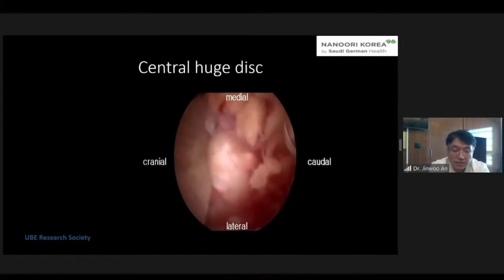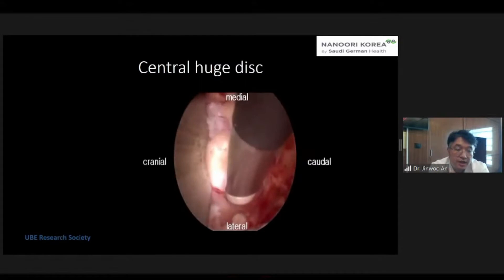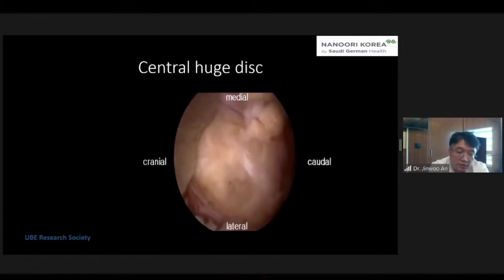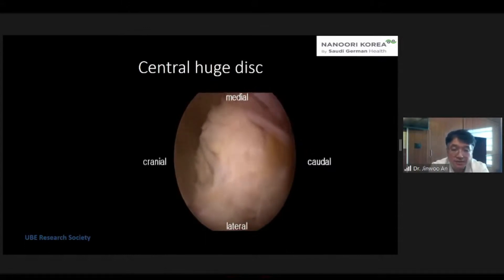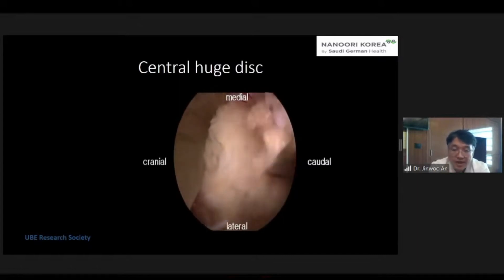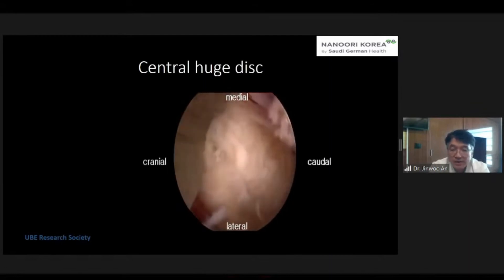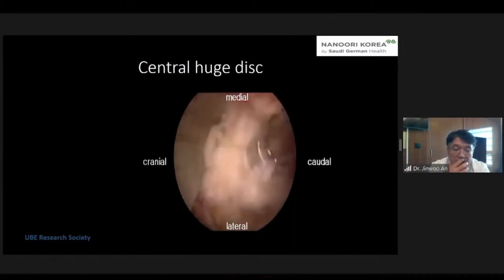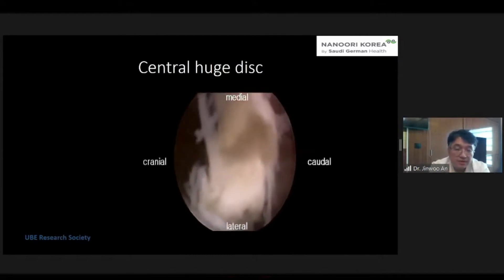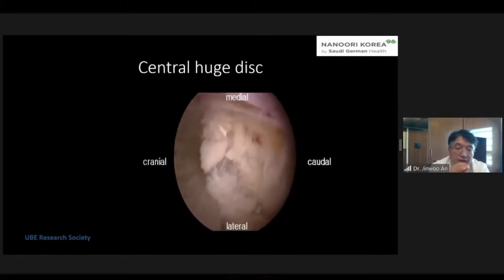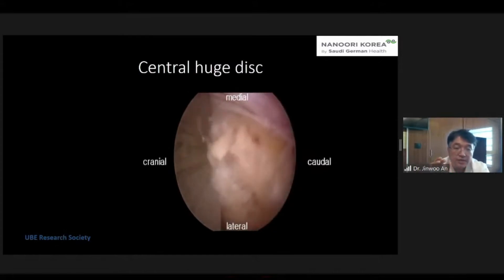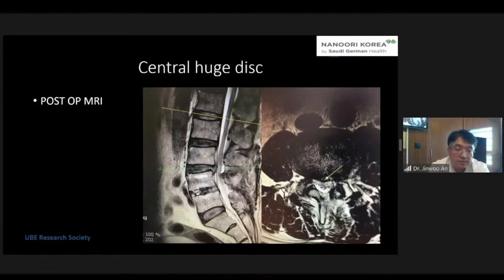Just moving and rounding and bleeding control with electrocautery and slightly moving to the dural-medial area, we can see the ruptured disc portions. Same way as microdiscectomy, but with small laminectomy and easy to find the disc rupture. After removing the huge central disc, only check the dural pulsations — I think that's enough to finish the surgery. The next slide shows the post-operative MRI: the central huge disc is removed and the patient's symptoms resolved.